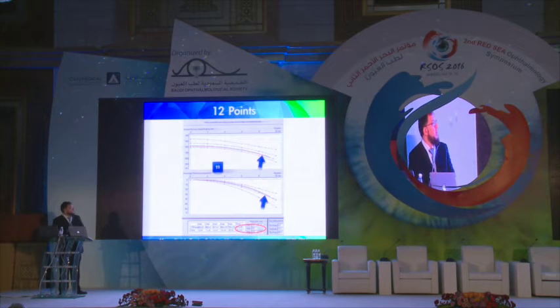The thickness profile describes the progression of thickness from the thinnest location towards the periphery of the cornea. The red curve here describes the curve of the examined eye, while the black dotted lines are for normal population. So we have to study the shape, and we have to study the average progression, as you see here.